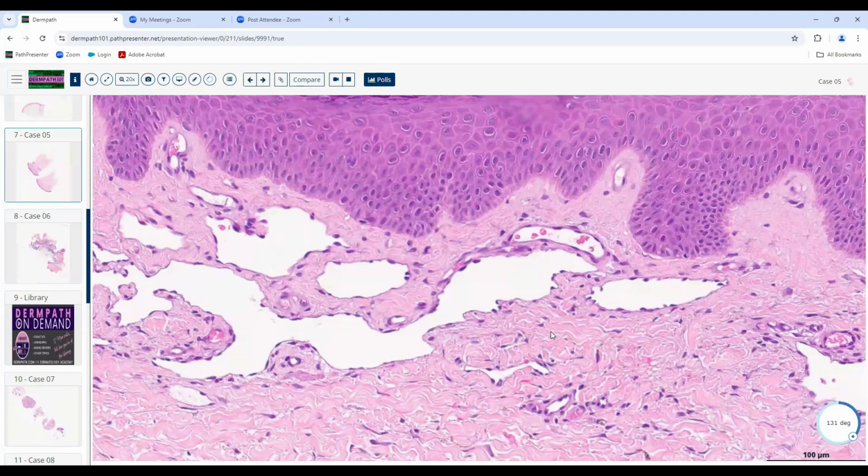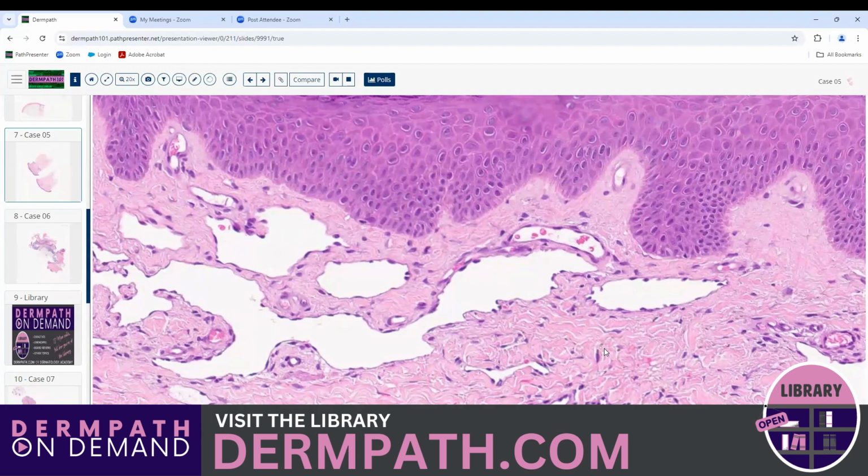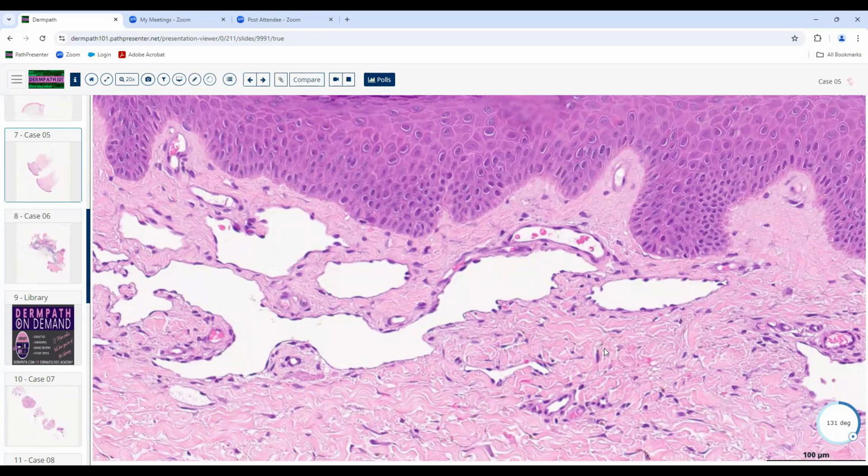There's one other situation, and this one you could possibly encounter on the board. If you get a lesion, let's say a reddish nodule, or maybe sometimes a multinodular plaque around the ear or the head and neck area, usually of a relatively young individual, and you biopsy that, it has very markedly thick-walled blood vessels, a proliferation of multiple thick-walled blood vessels with very prominent endothelial cells that protrude into the lumen, and they often have little vacuoles in the cytoplasm of those endothelial cells.